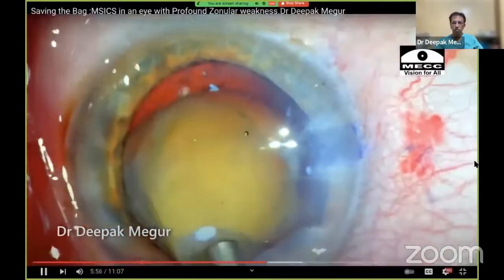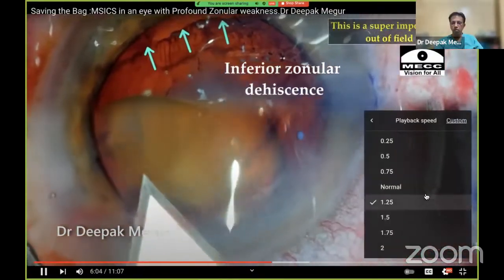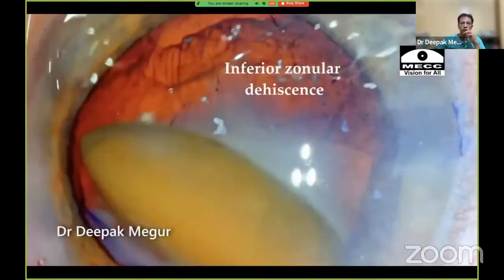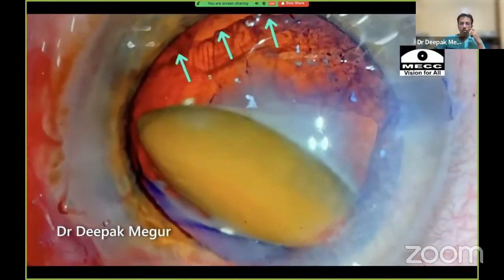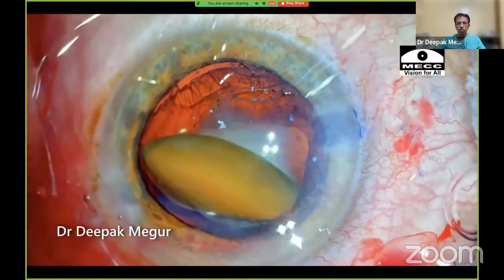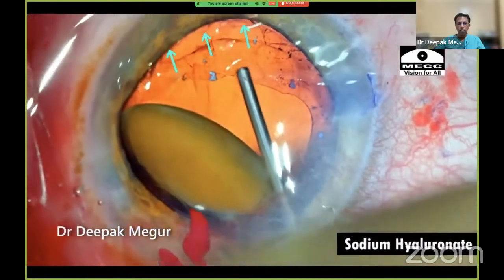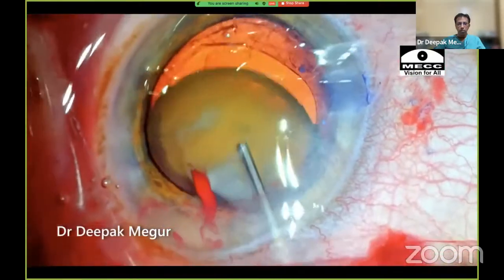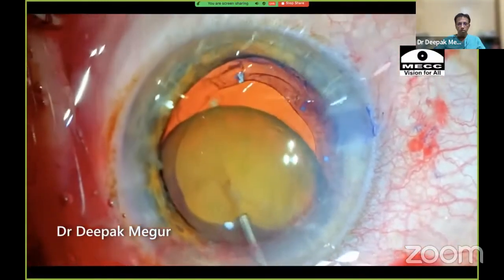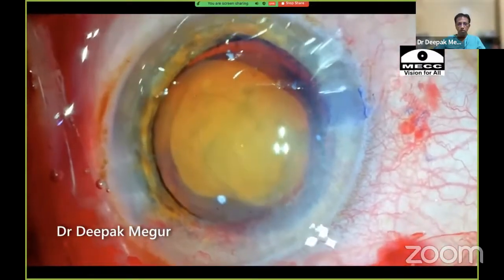Before prolapsing the nucleus out of the bag, I wanted to enlarge the incision. As I'm trying to enlarge the scleral tunnel incision, I can see that the inferior part of the bag has really come out — localized zonular dehiscence is very well seen now. The capsular fornix has come anteriorly and folded. I use sodium hyaluronate to fill into the bag, pushing the fornix back posteriorly. I need to fix this bag before removing the nucleus, otherwise I'm going to lose the bag. I push in more cohesive OVD to keep the bag and the chamber formed.